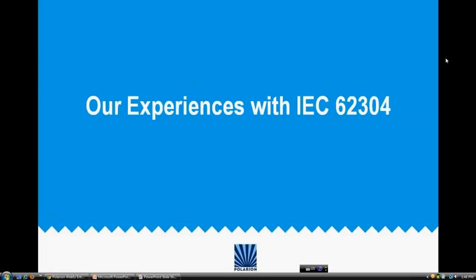So the mechanical issues around this were really to read the 62304, understand the purpose of all the different sections and all the different requirements, look critically at our particular product or service that we're generating, look critically at how we were going to do it, and make a determination all along the way about how we were going to defend each individual aspect of 62304 within our existing software processes.